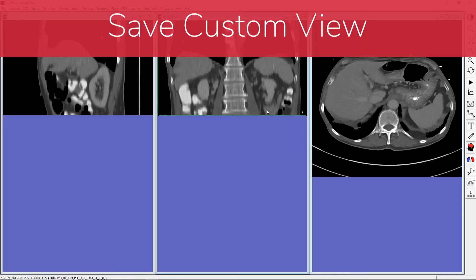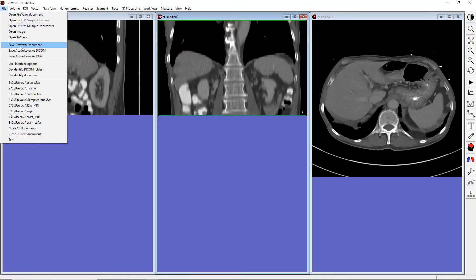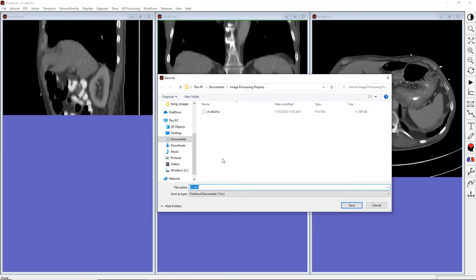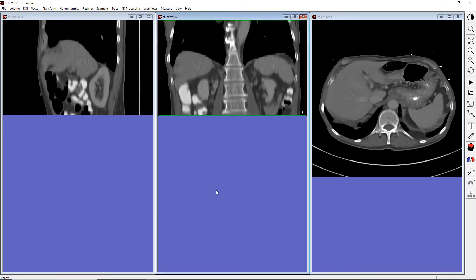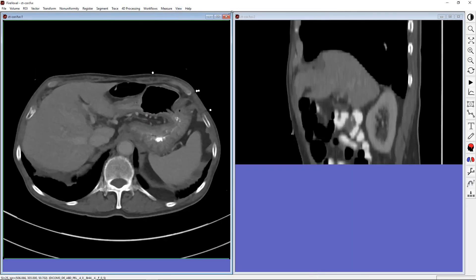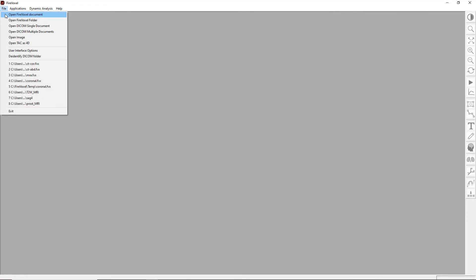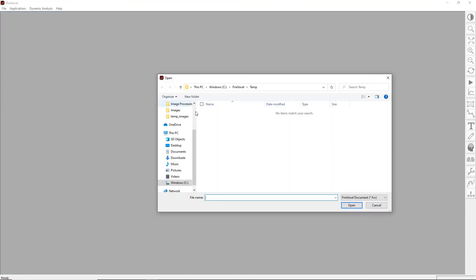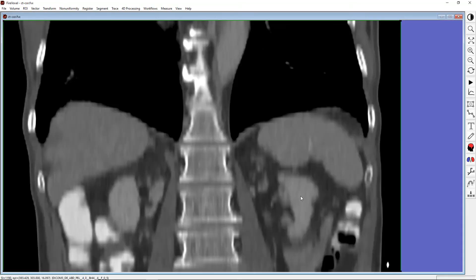If we want to preserve a particular custom view, we can save it as a FireVoxel document. For example, let's save this coronal view and close all windows. Now, let's reopen our saved document, and here is our coronal view as we saved it.